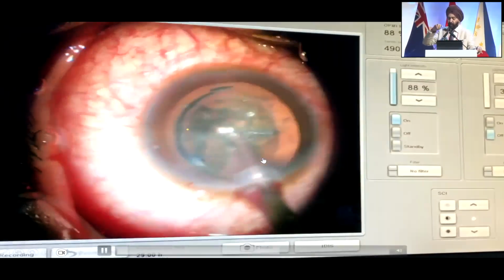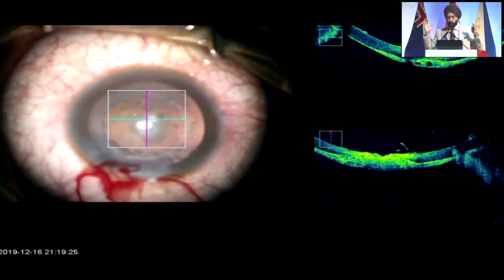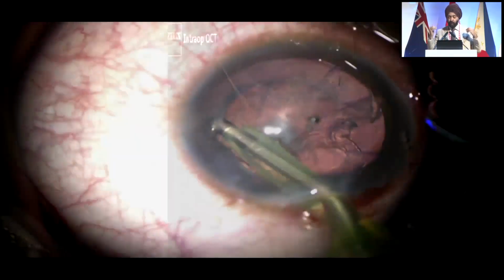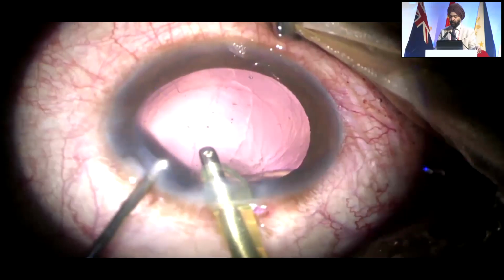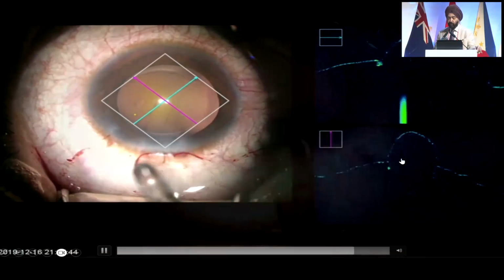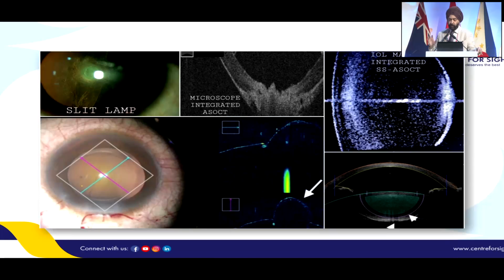The intra-op OCT, as you showed, has an epinuclear plate, but there is no dehiscence just now. What you see here is that I have been able to take out the entire nucleus, because the nucleotomy made it very easy for us to aspirate. Now just look at the huge defect that is appearing. And now we put viscoelastic. You see this huge defect is there. You can see a blob of vitreous on the intra-op OCT, and you can go ahead and put the lens in the bag.